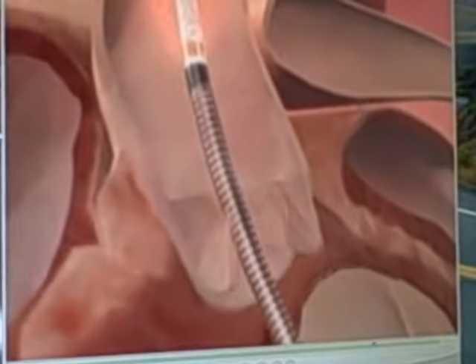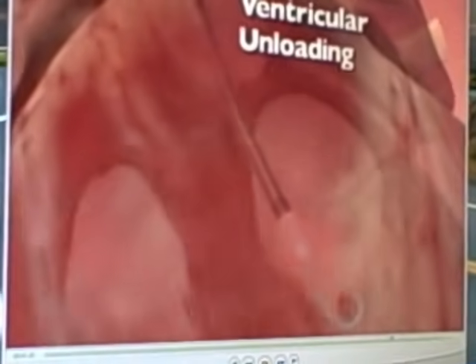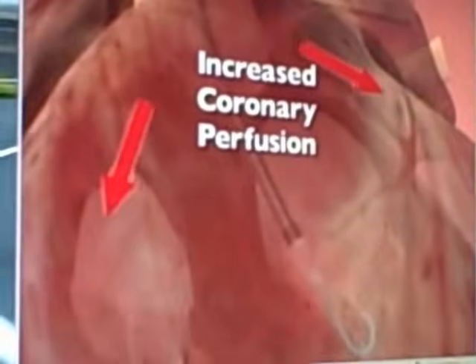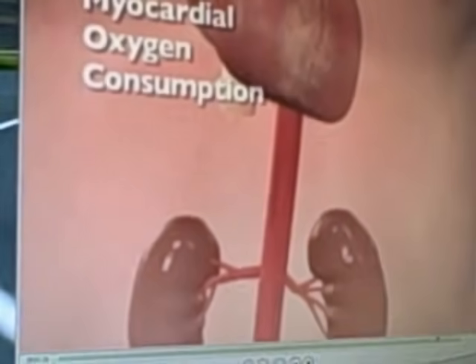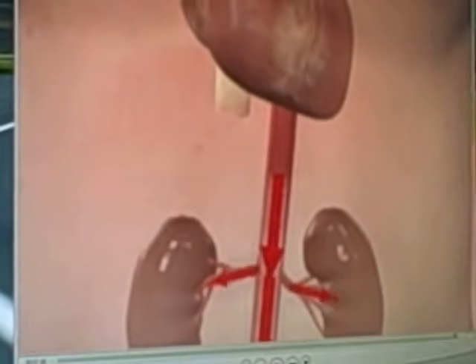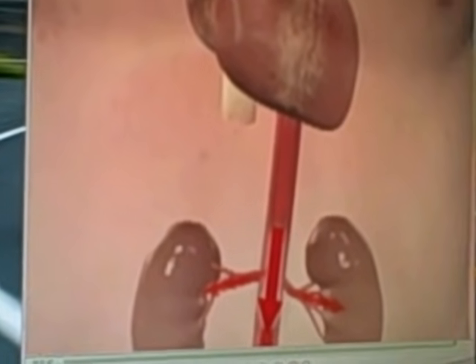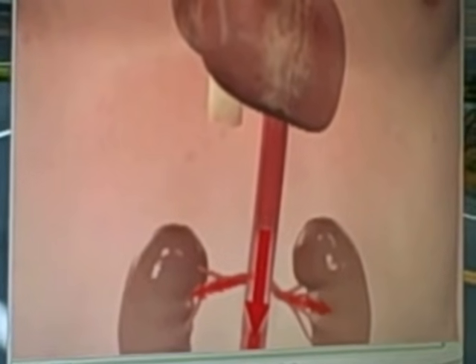The body is now receiving five liters of blood flow, as it would from a normal working heart. This increased blood flow improves perfusion to the heart, allowing it to work better, and also reduces the amount of oxygen the heart needs to use. Importantly, it also provides additional blood flow to the rest of the body, improving perfusion to organs such as the kidneys and liver.